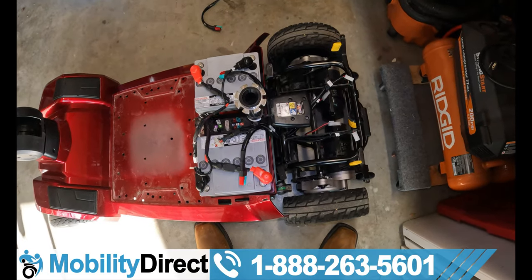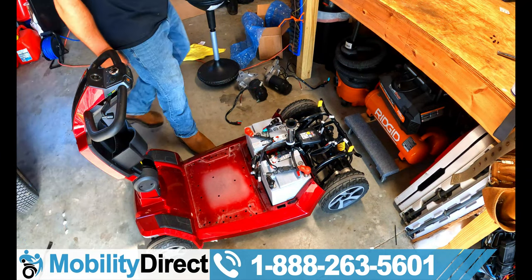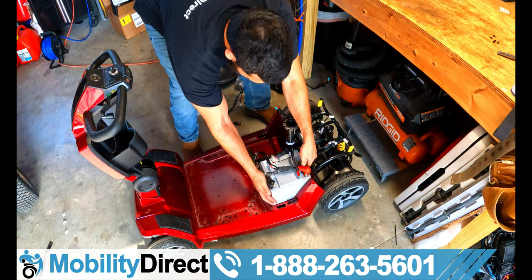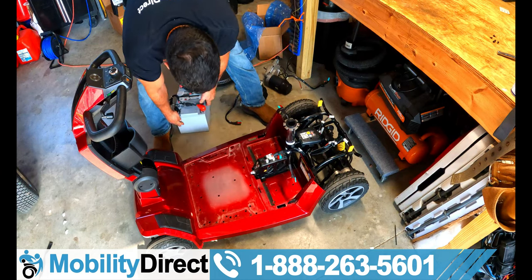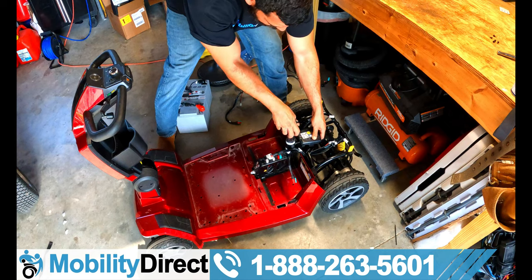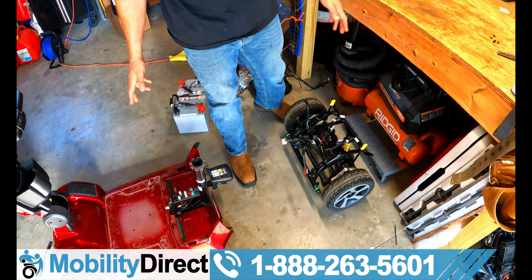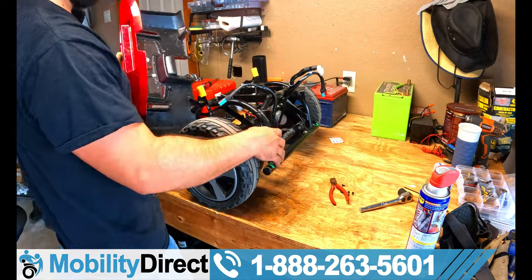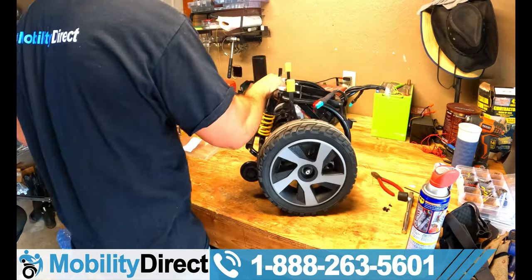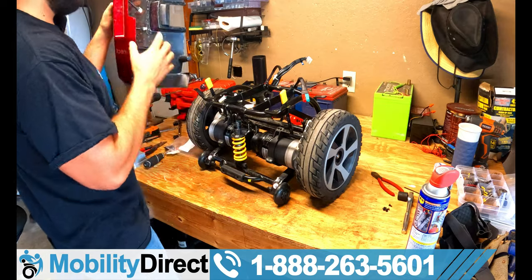Now you can detach the front half from the rear half. Detaching is pretty easy — reduce the weight by taking out the batteries first since these are heavy lead acid batteries. Then pull up on the lever with one hand, grab the seat post with the other, pick up and push forward. That's it. At this point we're getting ready to put everything back together — just take all the steps you took when removing the body panels and do them in reverse.